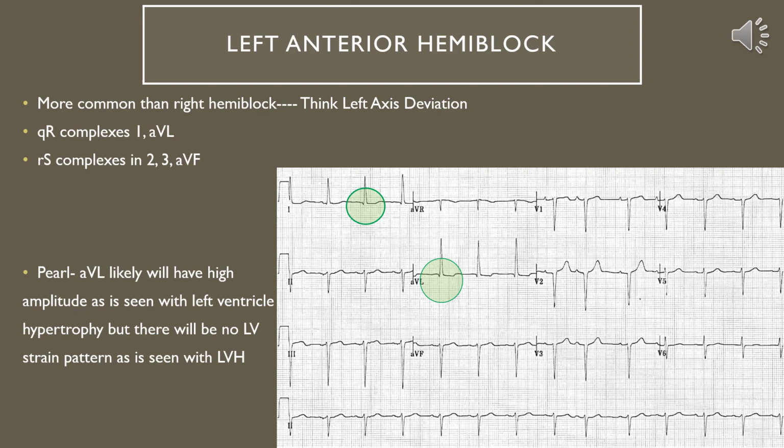You're going to look and see these QR complexes. You're going to see just a little bit of a dip before that QRS complex. And you can see that in lead 1 and your AVL here. Okay.